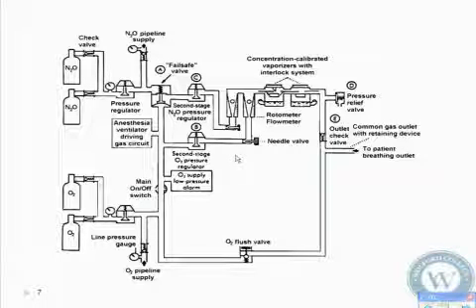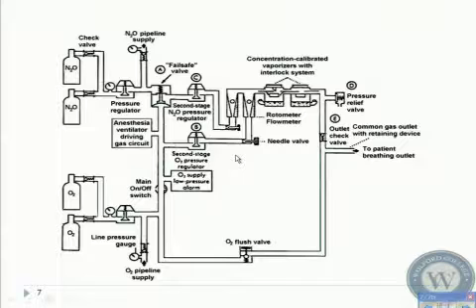Okay, now our machines, they could handle that type of pressure, but as soon as that cylinder is hooked up into our machine, it immediately regulates. So we're going to have a regulator on there, a pressure regulator that's going to drop that pressure down to more of that intermediate pressure, around 50. All right, so this valve right here, it's directly on the other side of your cylinder. As soon as you hook that cylinder up, there's a valve that sits just inside the machine. You can't see it. It's hidden in the body of the machine, but a valve is present.